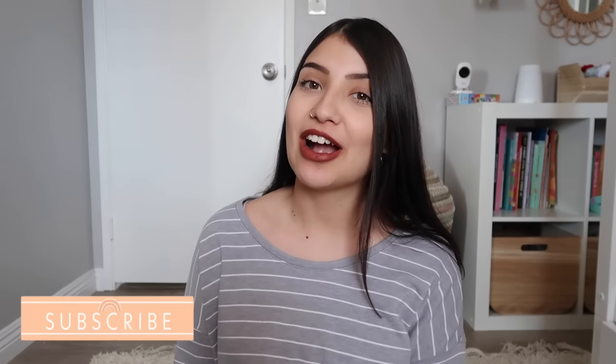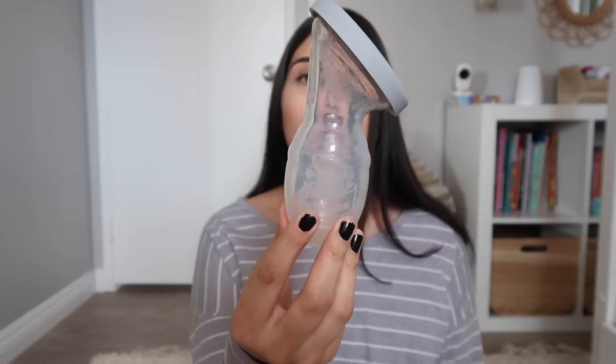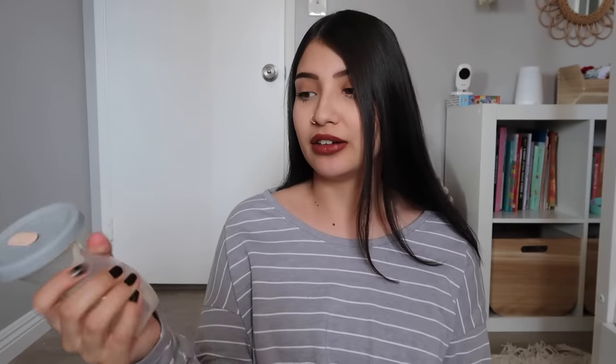Hey guys, welcome back to the Man Family. Today's video is going to be all about this guy right here. If you're not familiar with this, this is the Haakaa breast pump. I'm going to give you guys a full review on it, show you how it works, how I created a stash on it, and then share some tips and tricks. Here is what the Haakaa looks like — it is 100% food grade silicone.